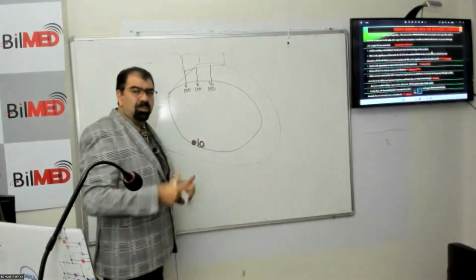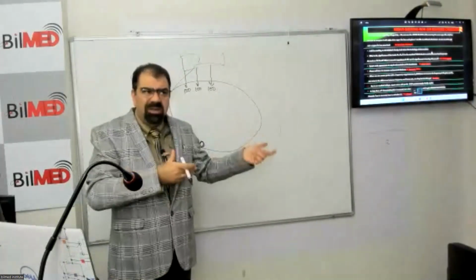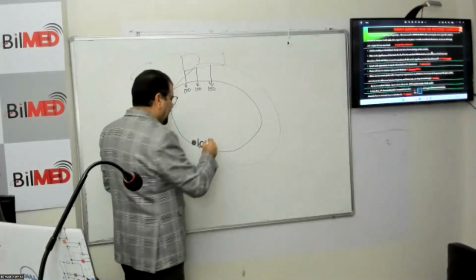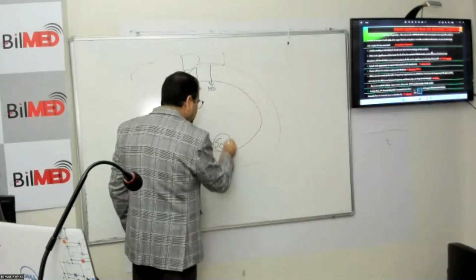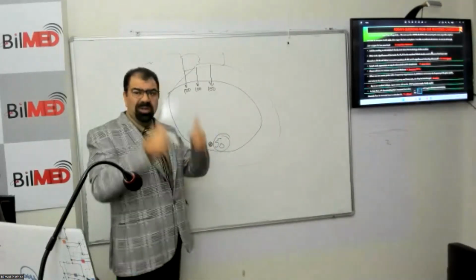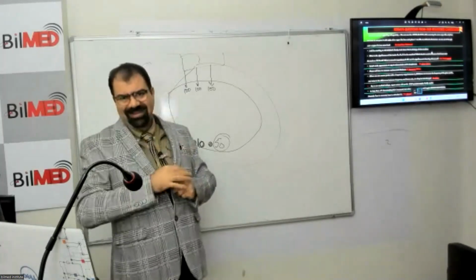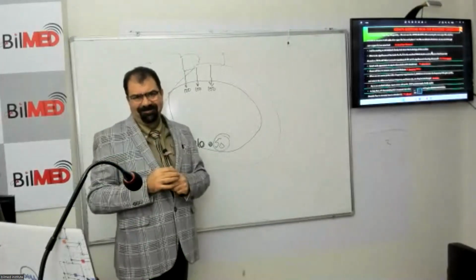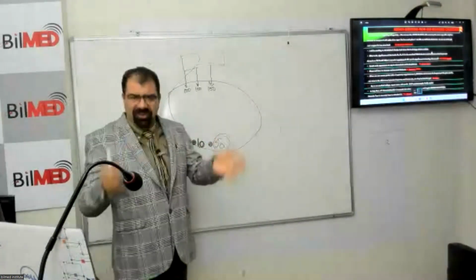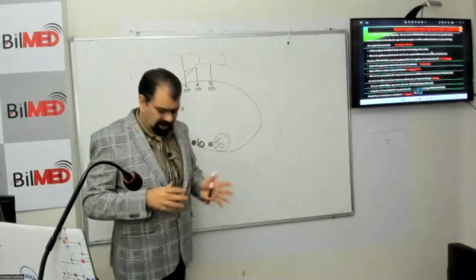But if this area is not as stiff as it was previously in some other part, if it is less stiff, I'm using a simple word, then it will not be 100, it can be maybe 50 over here when it reaches from this point to this point. It means that if this area is more stiff, the penetrating beam will get more attenuated. So this is attenuation. You have to be clear on attenuation. Now there is an attenuation coefficient also. Let's not indulge in these complicated terms. So the attenuation is defined by the stiffness of the organ.